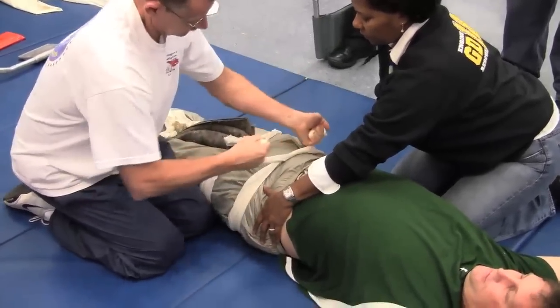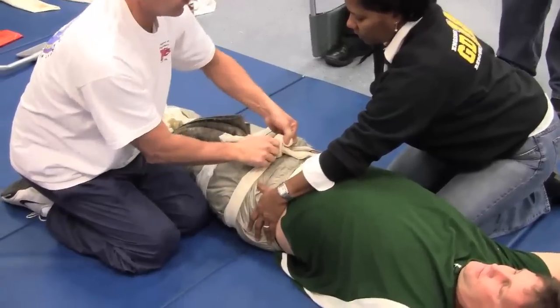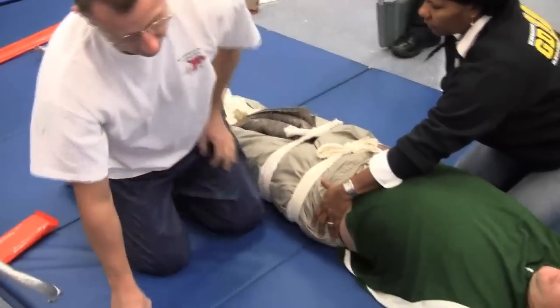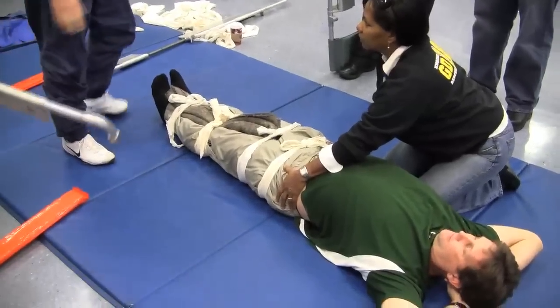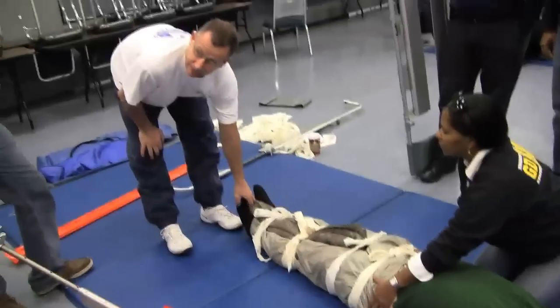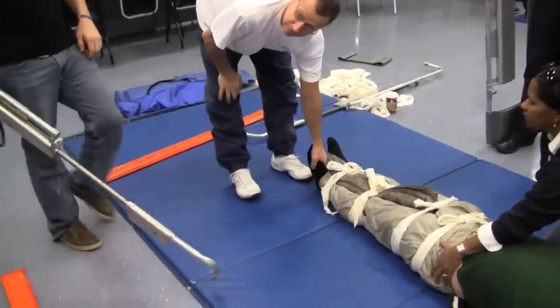Basically like this. Remember, I'm tying bows because I want to get them out of it. In actual practice I'm going to tie knots. So now he's all tied up. Come back and check — after I did one intervention I'm going to check back. I got a pulse there. He feels me. I tickle his toes.